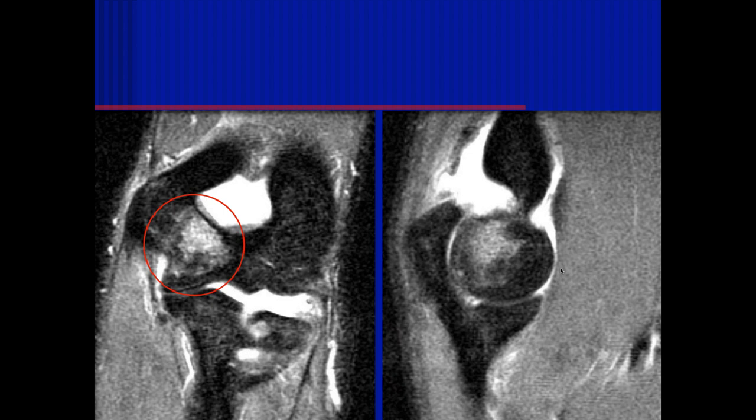So, Michael, what do you think of this one? Okay, so we see edema in the trochlea, and it looks like there's cartilage loss at the ulnohumeral articulation, with subchondral change as well. Cystic changes there.